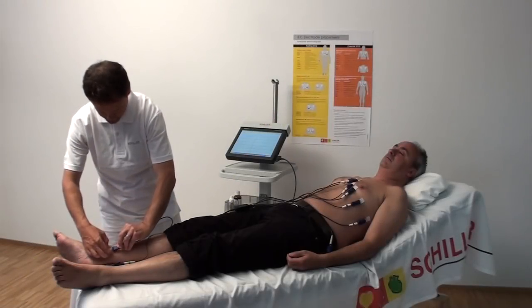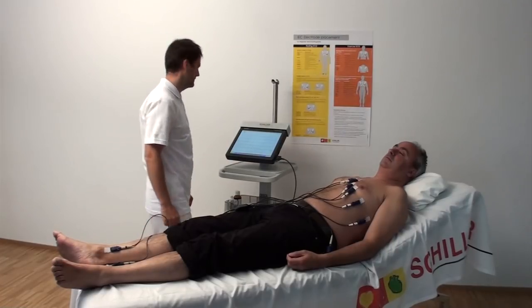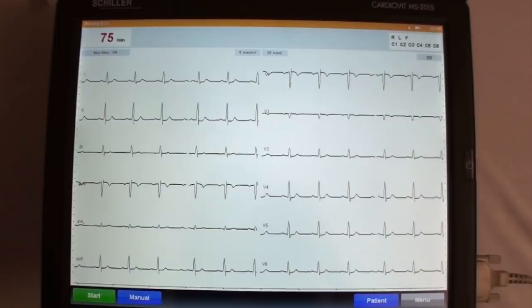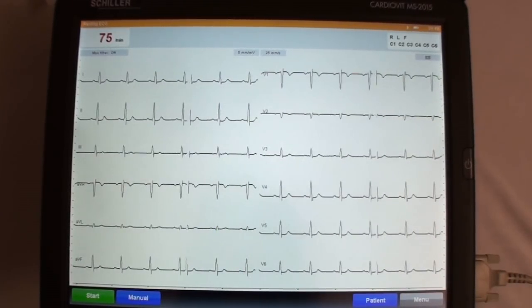After the electrodes have been placed on the patient, connect the patient cable leads to the electrodes. Check the ECG signal on the screen and ensure that a good signal is displayed.